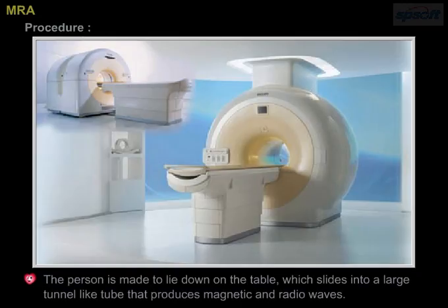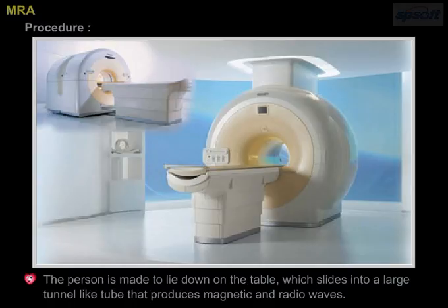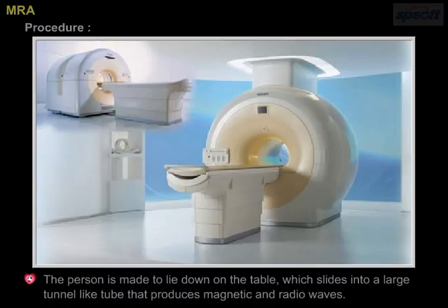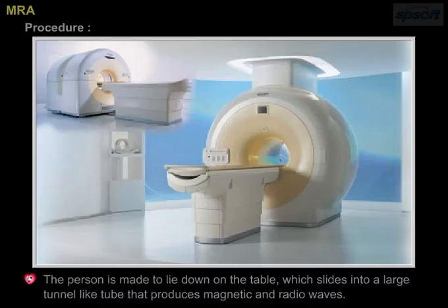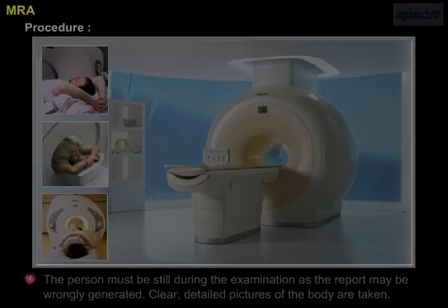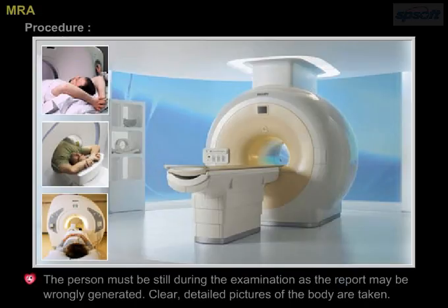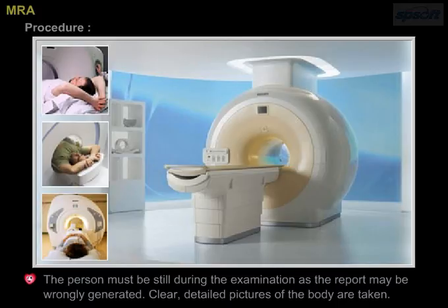The person is made to lie down on a table which slides into a large tunnel-like tube that produces magnetic and radio waves. The person must remain still during the examination, as the report may be wrongly generated. Clear, detailed pictures of the body are taken.